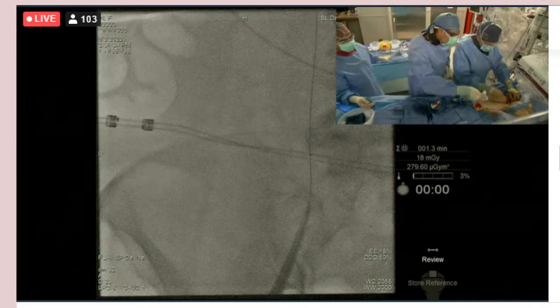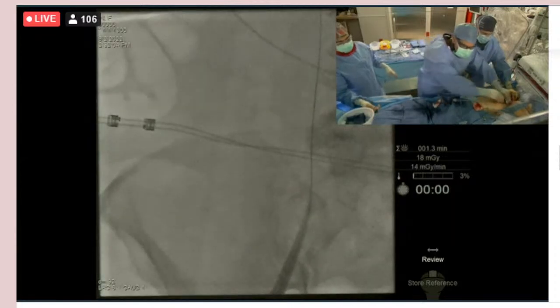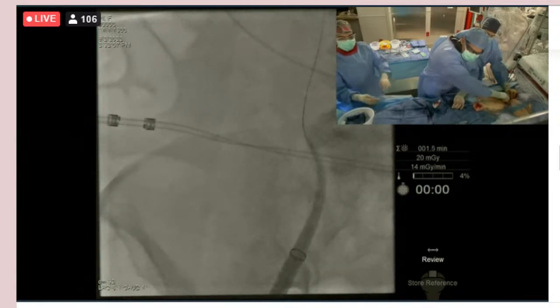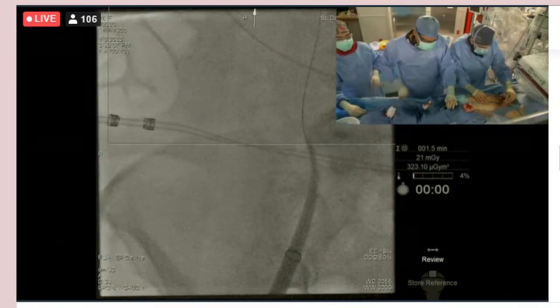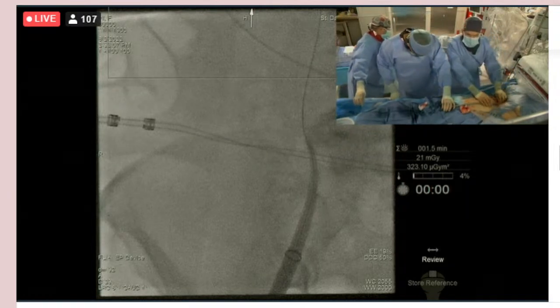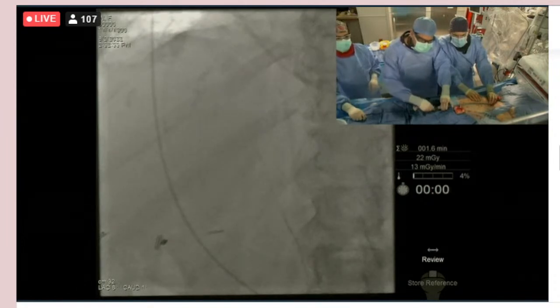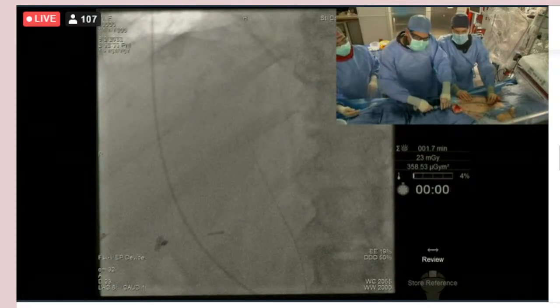You know, even peripherals, injecting contrast sometimes. I have done one Micra where the IVC filter was occluded, so we had to dilate through that and put the Micra through, injecting contrast. Yeah, it looked like your wire was already up in the heart, so we know that you're going through the IVC. My concern is the peripherals is what's hurting me here. The wire came back a little bit. What's that?